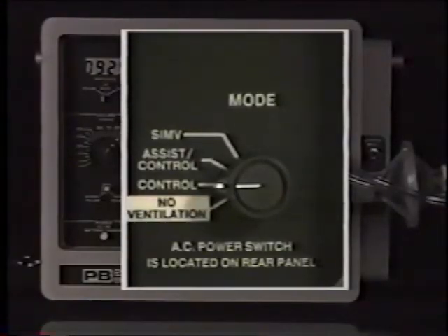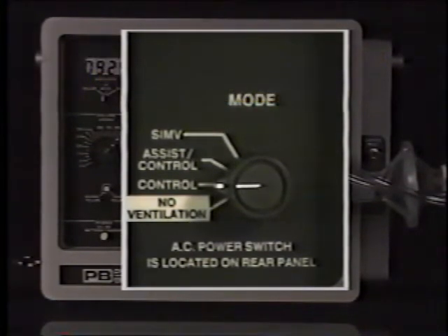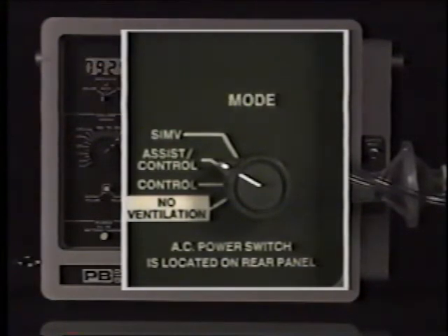The control mode is for patients that cannot initiate spontaneous breathing. Patient ventilation is initiated by the breaths per minute rate switch, which is adjustable from 1 to 69 breaths per minute. The assist control mode is for patients who are capable of initiating ventilator breaths, but may become too tired to sustain breathing. Now, if the patient fails to initiate a breath, the ventilator automatically reverts to control ventilation and delivers breaths at the set breath rate or until the patient initiates ventilation. The set breath rate guarantees patient ventilation.